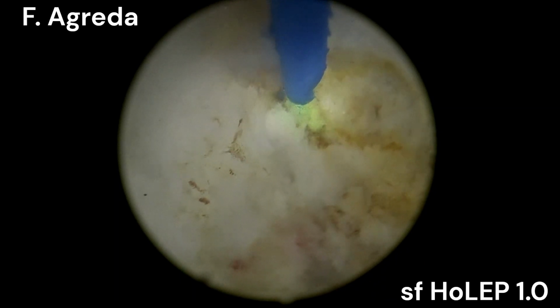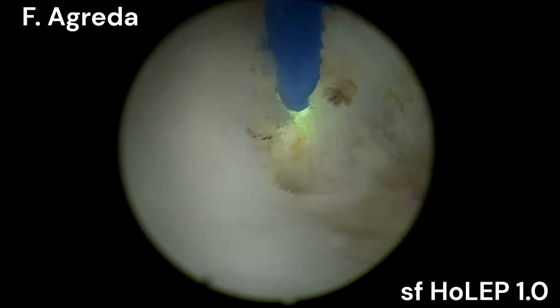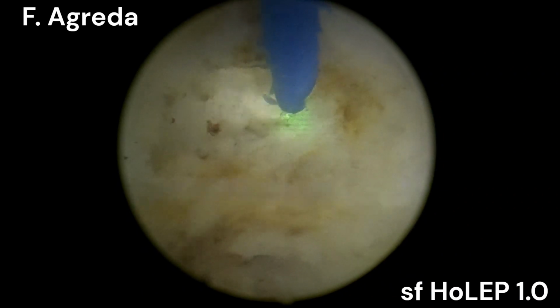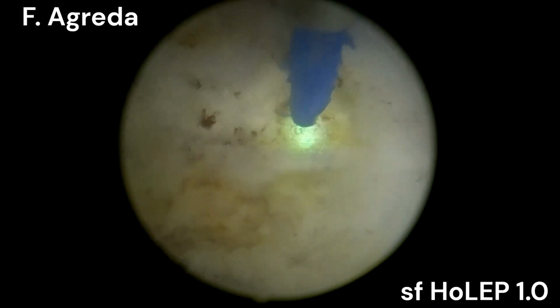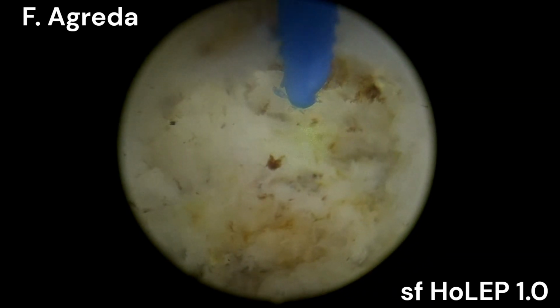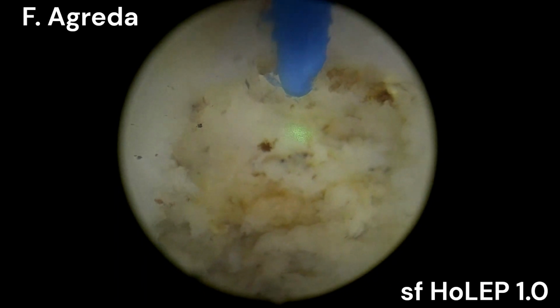So I just needed to cut very progressively through the urethral epithelium, through the urethral fibers, and through a section of adenoma, because it's impossible to go straight in this plane without leaving some adenoma in the dorsal, anterior aspect of the prostate, anterior distal aspect of the prostate. I'm doing that same movement here, and I'm going from 3 o'clock to 9 o'clock, very progressive, very slow, till I get some circular fibers, which means I'm in the prostatic capsule, anterior prostatic capsule.